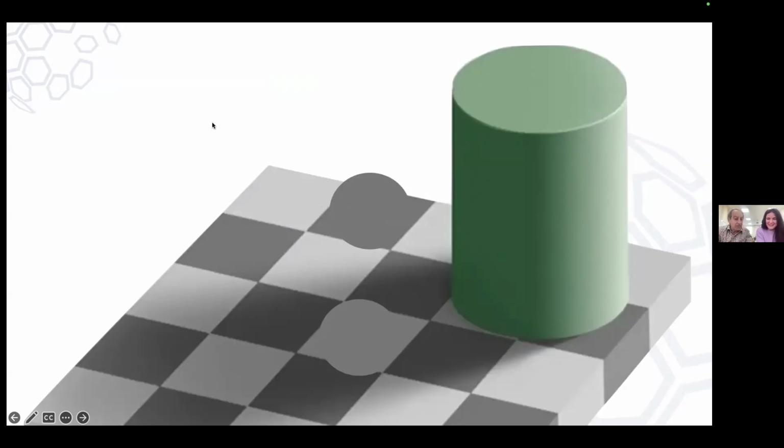This is why sometimes we see things that we swear are membrane staining, very faint membrane staining. But then when we ask a machine, like image analysis, whether there is membrane staining, it says there's no membrane staining here. It's gray. It's not real DAB. These illusions happen at very high magnifications, so be careful. I don't say don't use it, but be wary that you may be fooled. Usually you will see staining at times 20. Then maybe you put on times 40 to see better, but you should see it at times 20. If it only appears at times 40, think very carefully.